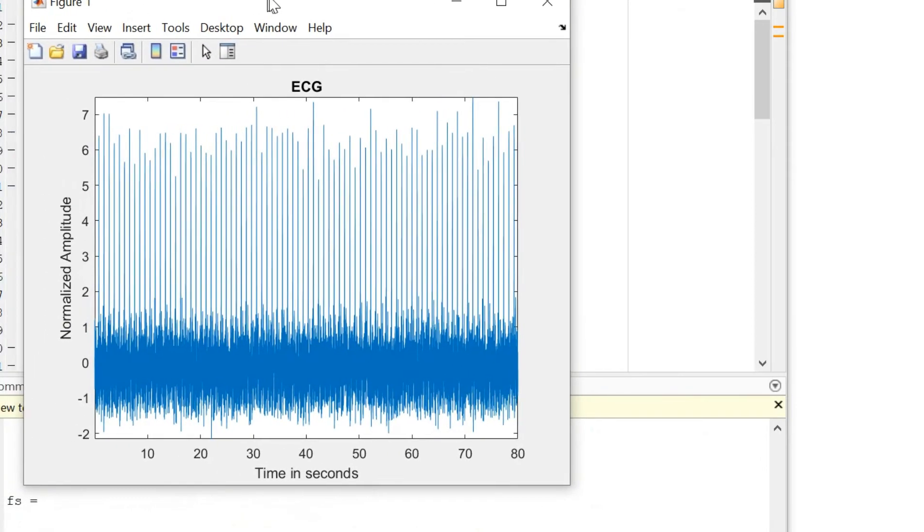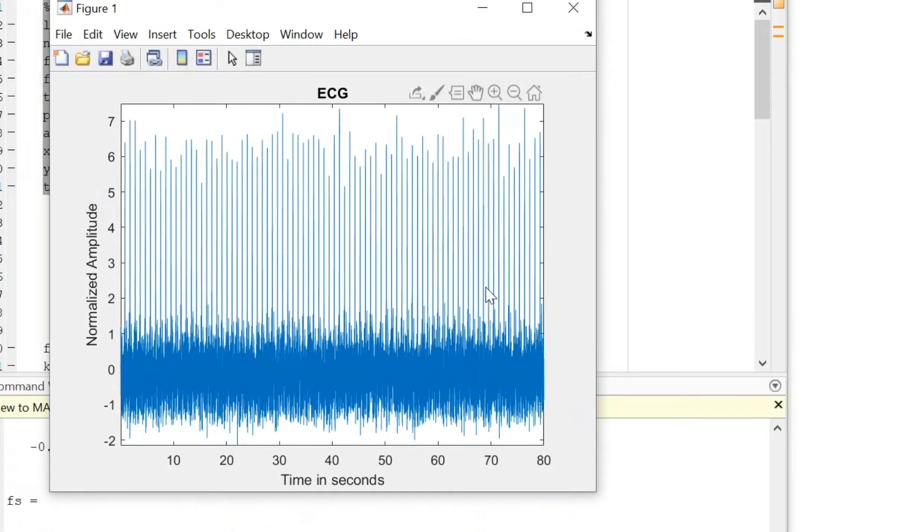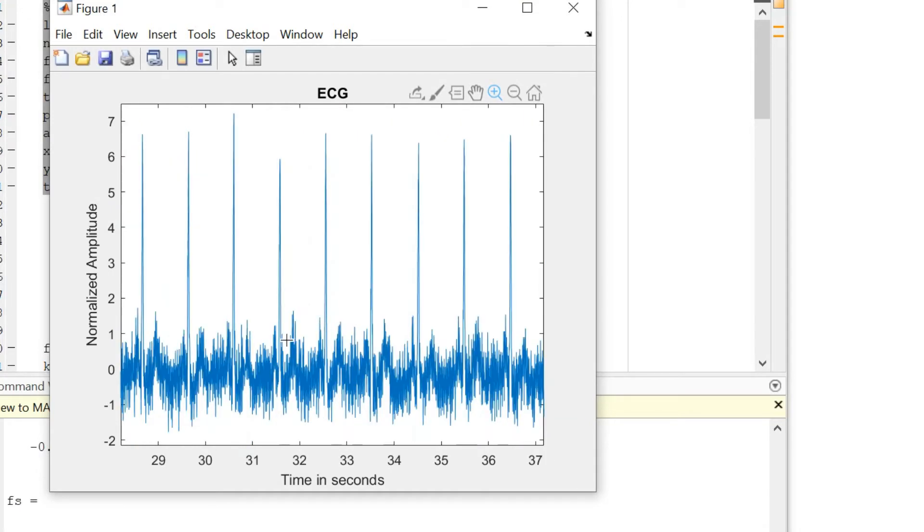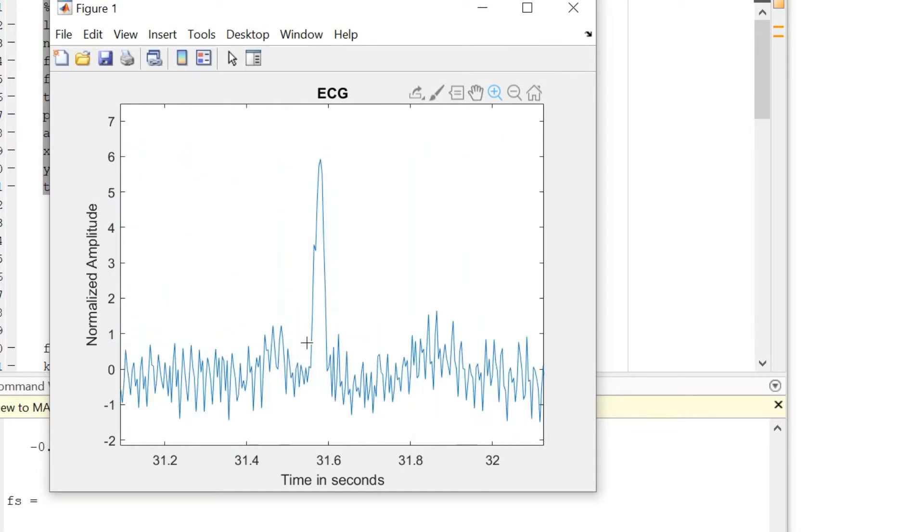And we see that our ECG signal looks like this. We can zoom into one particular segment and see what kind of data we are working with.